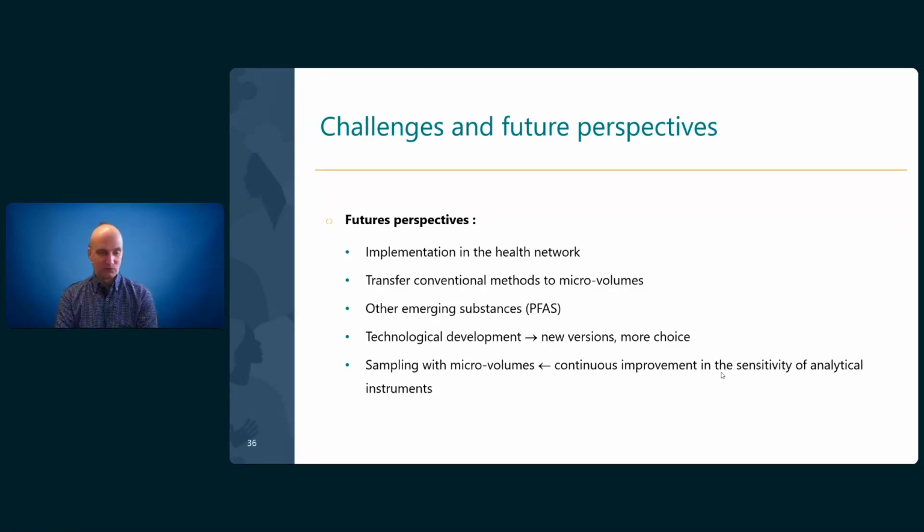And we all know that there are other emerging substances which are showing high interest, like PFAS and others. So we work on that aspect, not only, as I already mentioned, developing and validating a method for isotope ratio of lead, but we are also targeting PFAS in whole blood.